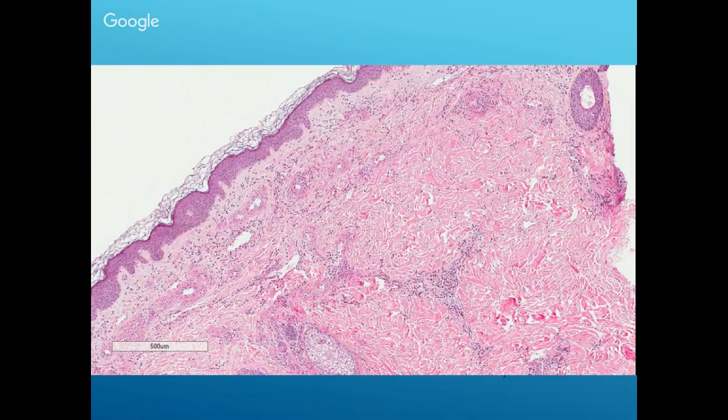So if I see vasculitis, what is the definition of vasculitis? When you're talking about tonsillitis, or any itis, you're talking about inflammation of that organ. Tonsillitis is when you're seeing inflammation in the tonsils, or actinic cheilitis is inflammation in the lips. So we saw the neutrophils in the dermis. In the last one you saw the neutrophils, so there was inflammation in the dermis, but why is it not called vasculitis? You have to remember in the skin, vasculitis doesn't equate to presence of a lot of neutrophils.